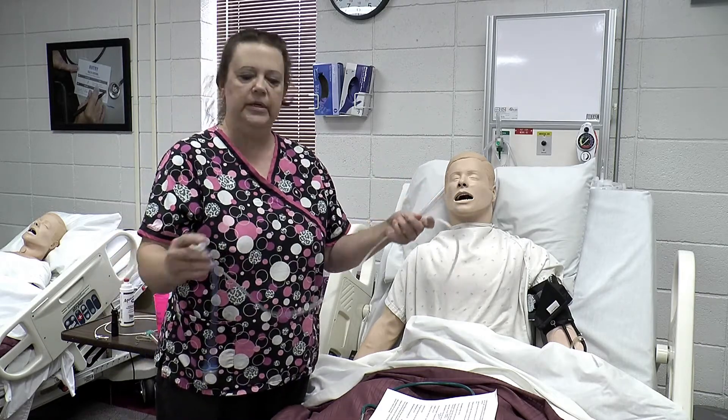Explain the procedure — tell him that we're going to put a tube down his nose and it will go into his tummy to decompress his stomach, and it will help his nausea and distension. Tell him we're going to need his help because it will make it easier to put the tube down. Explain that when we put the tube down, he'll take small sips of water and swallow — that way we make sure we get the tube into his stomach and not into his lungs. Tell him it is uncomfortable and not a pleasant thing, but it will also give him comfort because he won't be nauseated and hurting.